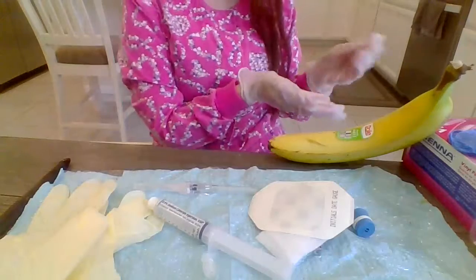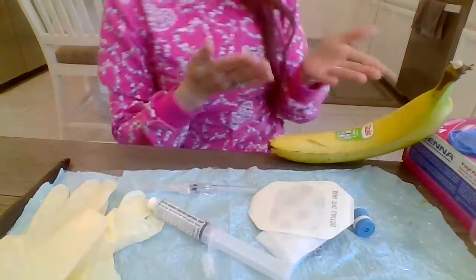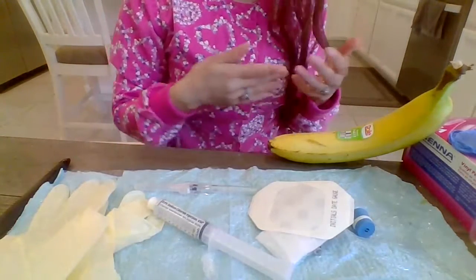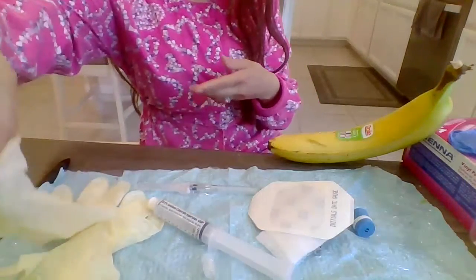Now I'm going to change my gloves. I'll wash my hands for 20 seconds. Now I'm going to put on my sterile gloves by touching just the inside of the gloves.